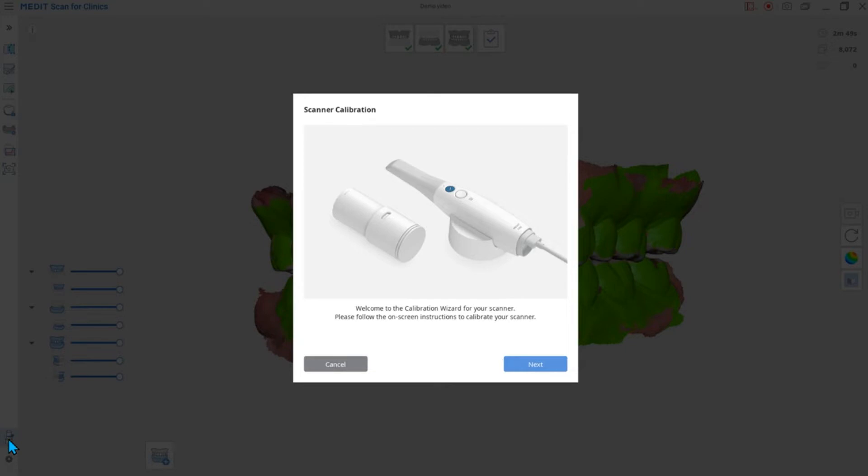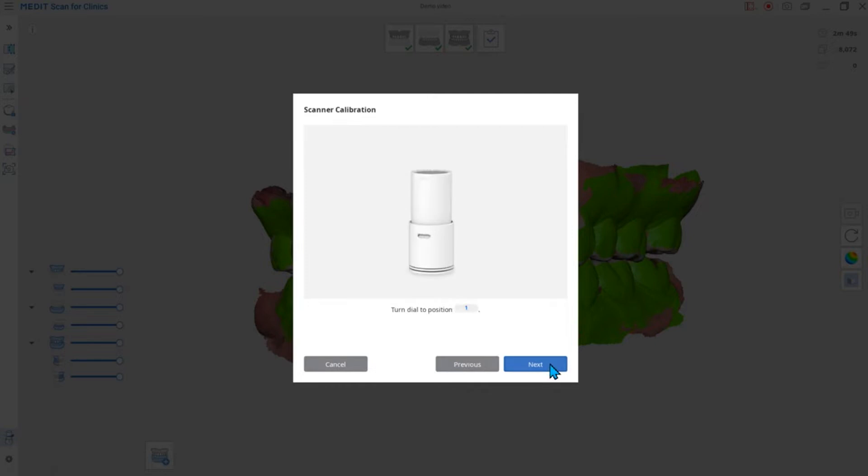You can follow the guide message on the screen. Turn the scanner on and connect it to the calibration tool. Click the next button to start the calibration process.